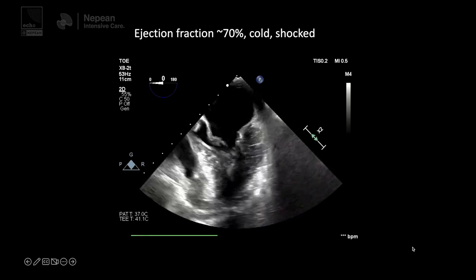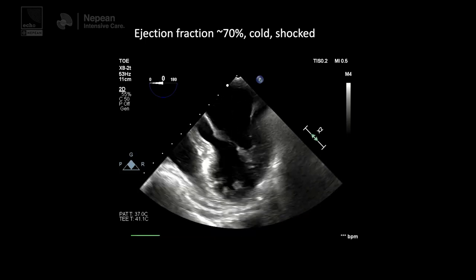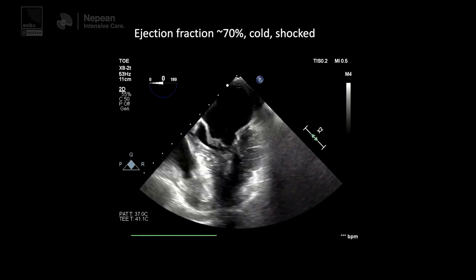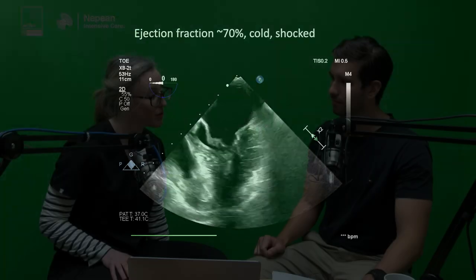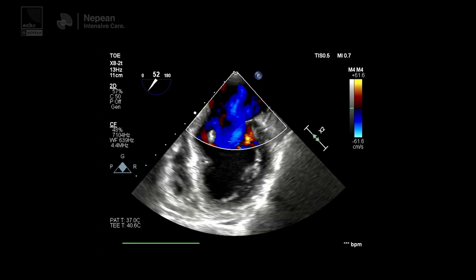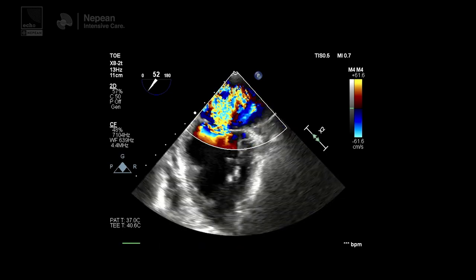This patient unfortunately had a ruptured papillary muscle — the posterior medial, as it often is because of its single blood supply from the RCA. So that was ripped off. She had rip-roaring severe acute mitral regurgitation. This is a classic example of uncoupling between ejection fraction and cardiac output — this patient would be in that box of high ejection fraction but low cardiac index. We put a bit of color on and you can see a horrific MR jet with super turbulent flow — a pretty bad case of MR.